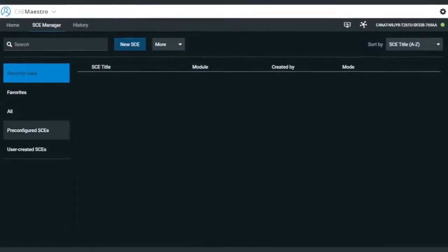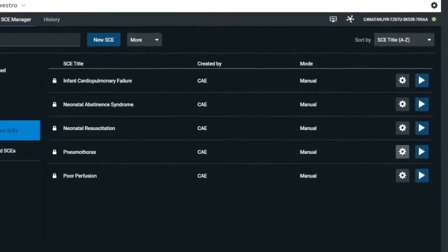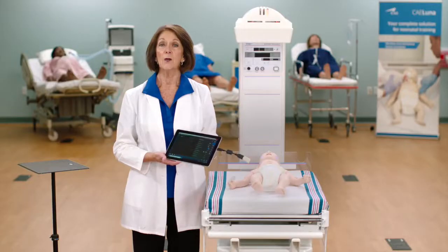Pre-configured within Maestro are five pre-programmed simulated clinical experiences that correlate to newborn assessment and resuscitation standards. Luna Live and Advanced can also be upgraded to include Maestro Physiology, our sophisticated mathematical models of human physiology and pharmacology that automatically determine the effect of user actions and interventions.